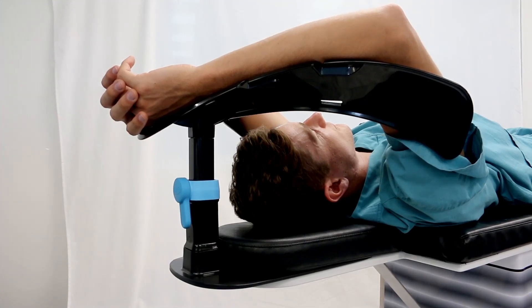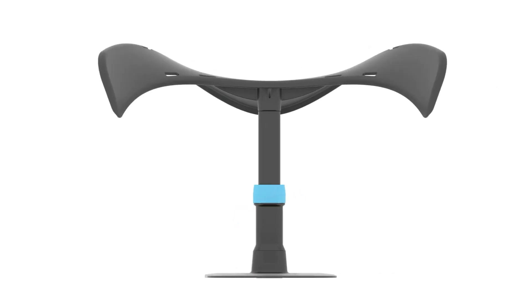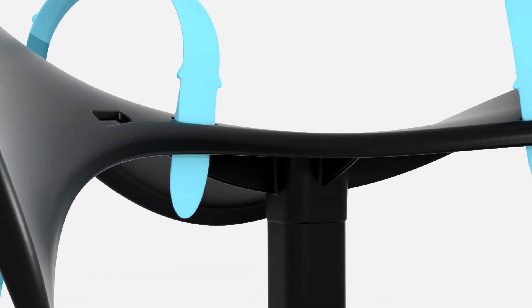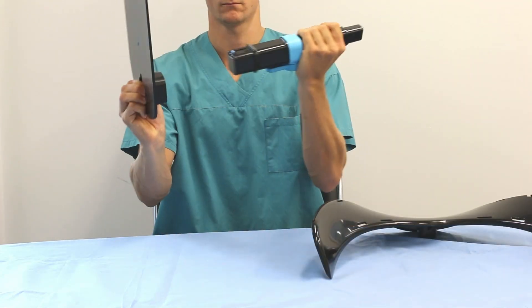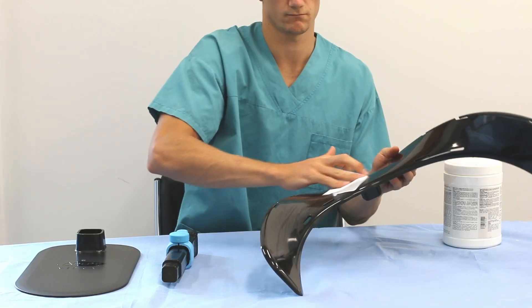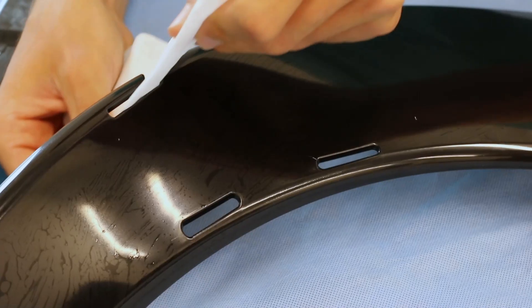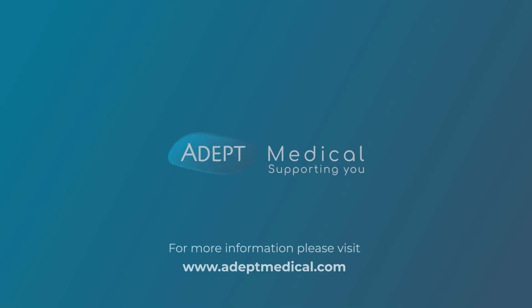The overhead arm support is crafted from high-performance engineering plastics for enhanced rigidity, durability, and resistance to chemical attack. It is lightweight, compact, and easily dismantled for storage. For cleaning after use, it can simply be wiped down with a disinfectant, and the wing and dagger board can be removed for washing. This forms part of a complete range of table accessories — visit the website to view the full product portfolio.